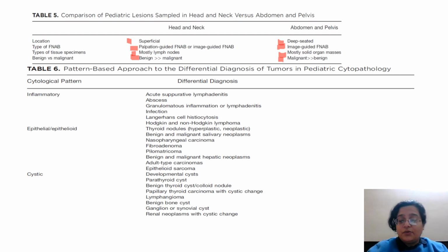Langerhans cell histiocytosis can also give you an inflammatory kind of a smear, but that will be rich in slipper-shaped, long epithelioid kind of cells, macrophages, a lot of macrophages, and you might see grooving in the nucleus of those cells. And a background population of few to fair number of eosinophils should point to a diagnosis of LCH rather than TB. Hodgkin's always confuses with a granuloma.